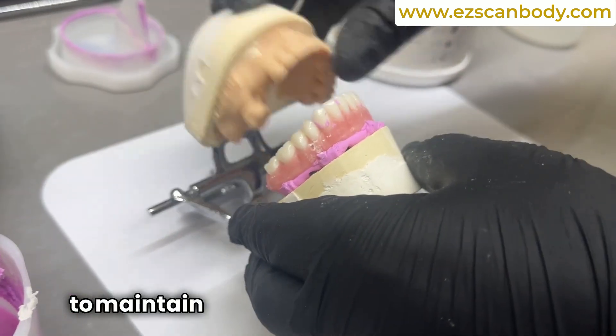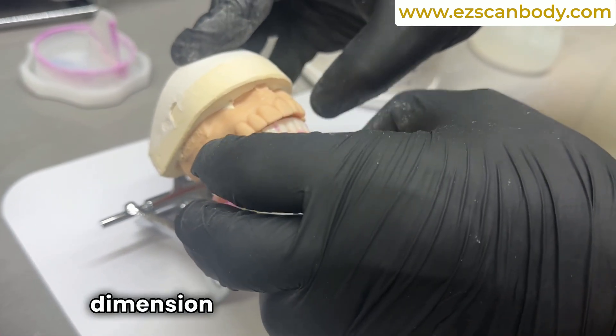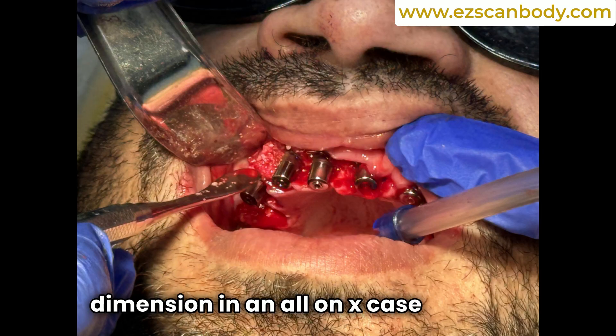In this video, we demonstrate how to maintain the bite and vertical dimension in an all-on-X case after the extraction of the teeth.